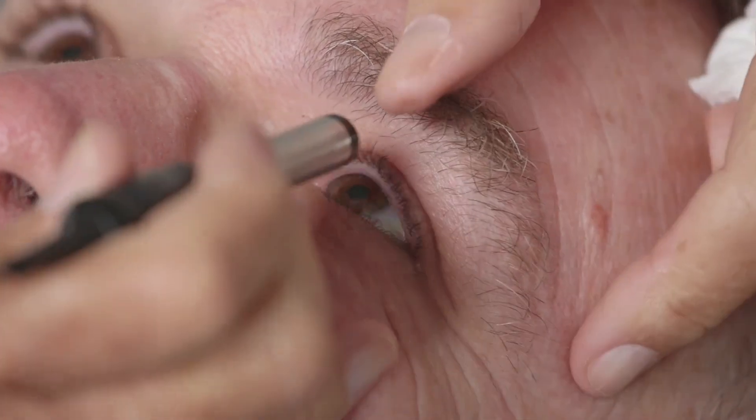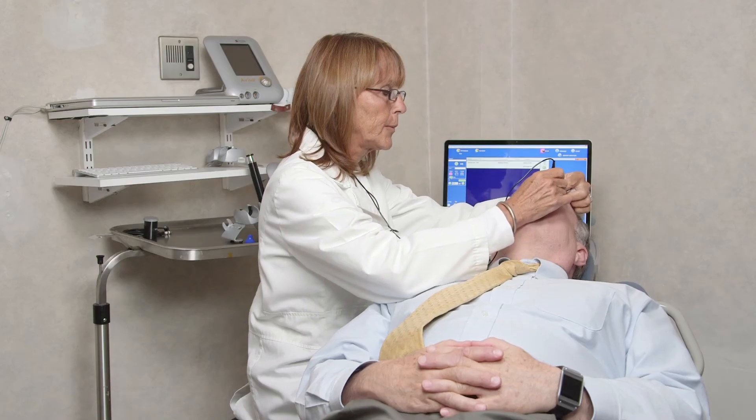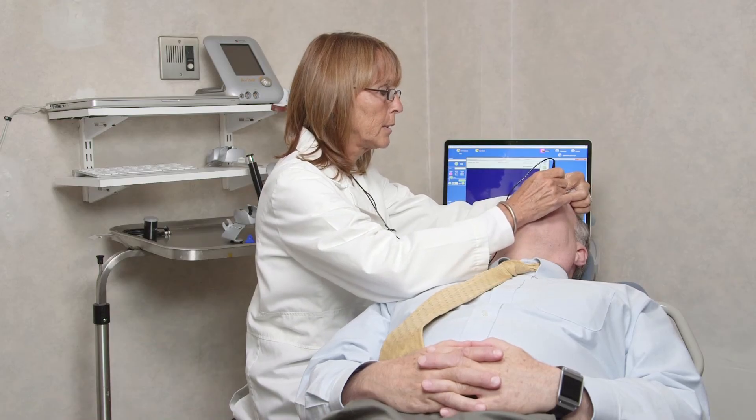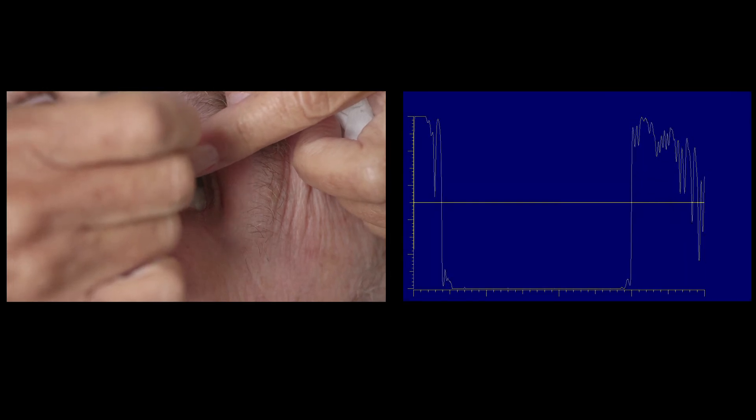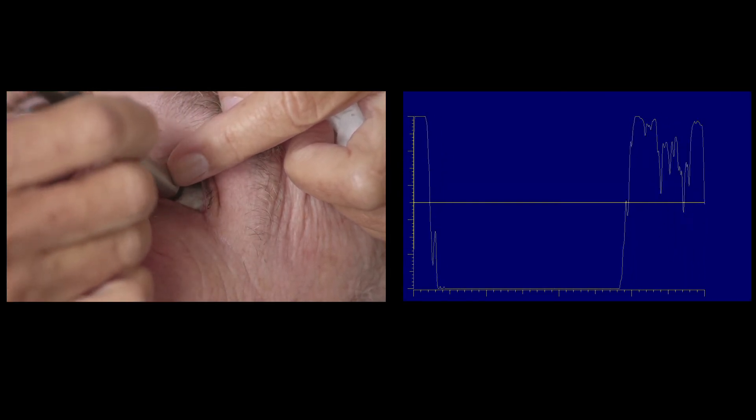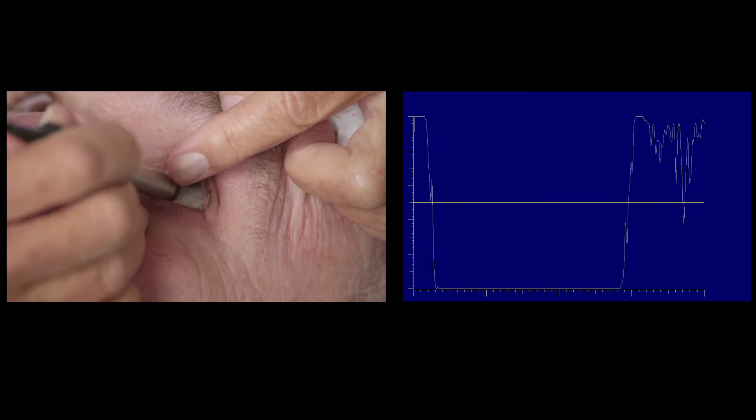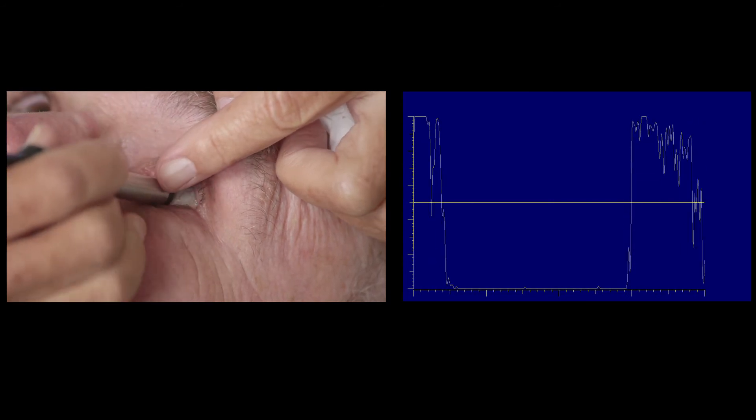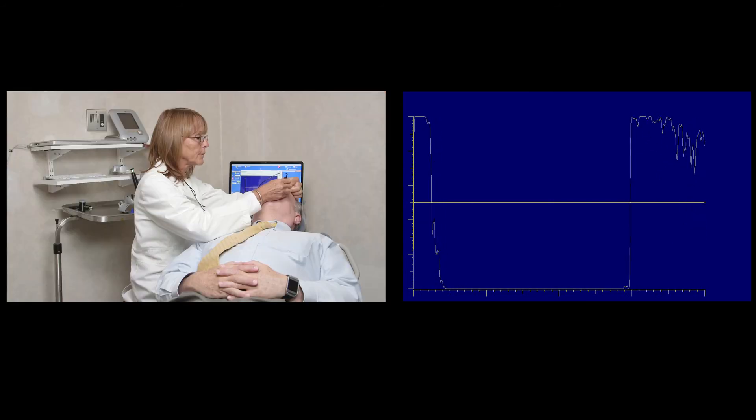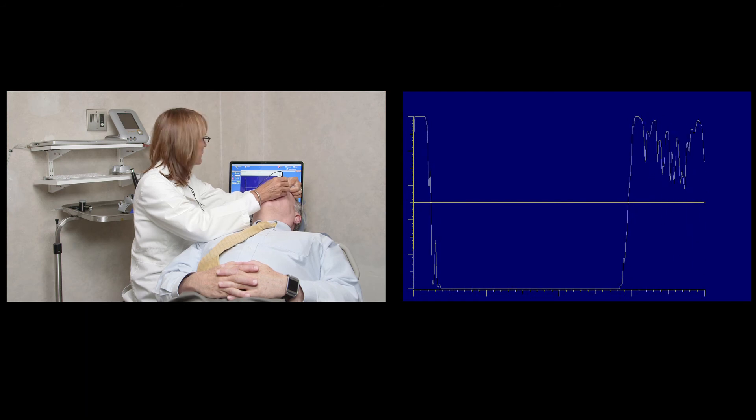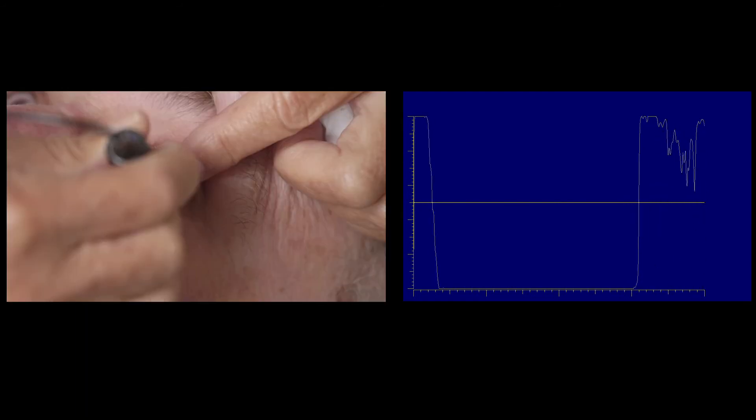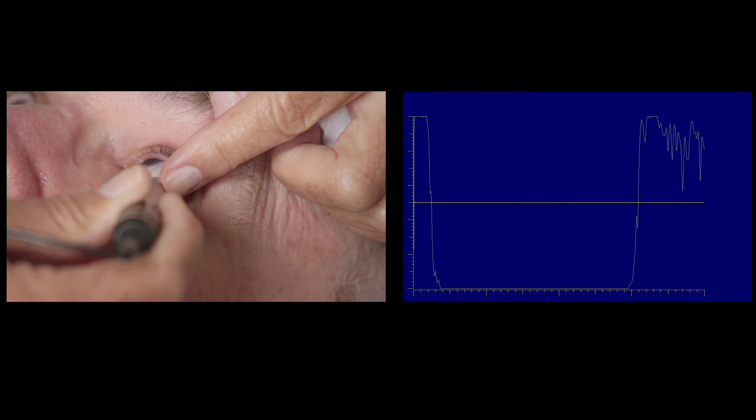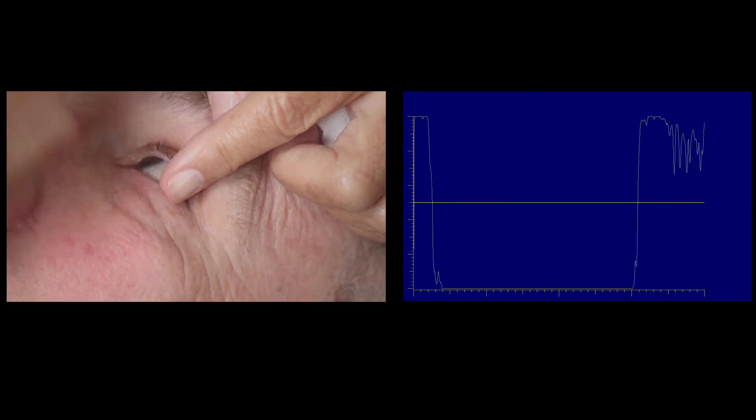The patient should be instructed to fixate in the same direction as the area to be examined. For example, if the area of interest is located superiorly, the patient should look up. The probe is then placed inferiorly at 6 o'clock near the limbus. Once perpendicularity to the superior posterior pole is achieved, the probe is slowly shifted into the fornix, directing the sound beam toward the periphery.